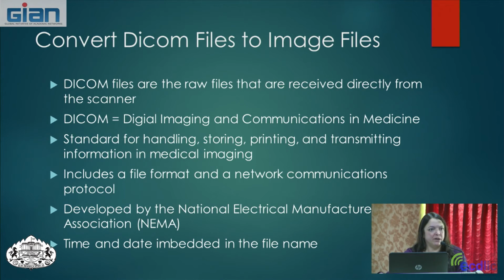And with working with these files over the years, I've learned that a lot of information is actually embedded in what looks like a string of numbers. I think I have some examples later when we look at an actual data set from start to finish, but you can actually get time and date information from some of the raw files just by looking at them, which is good to know in case you lose track of which data came from whom, which we don't typically do. We don't like to mix our data up. It's too expensive for that. But if we do, then we can go back to these DICOM files and get some information out of them.